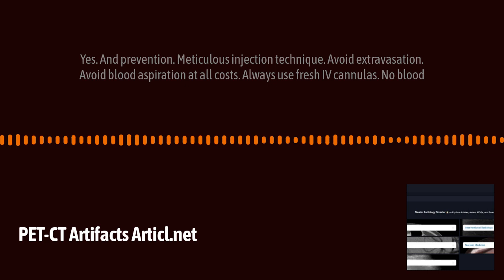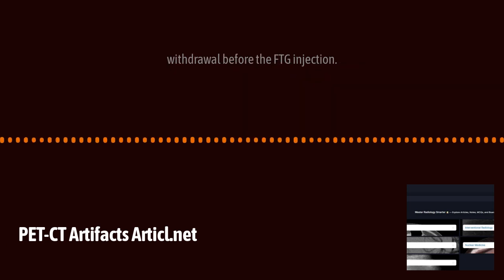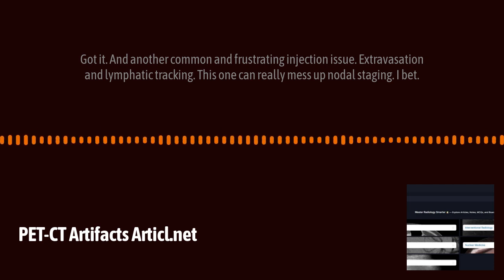Yes. And prevention: meticulous injection technique. Avoid extravasation, avoid blood aspiration at all costs. Always use fresh IV cannulas, no blood withdrawal before the FDG injection. Got it. And another common and frustrating injection issue, extravasation and lymphatic tracking.